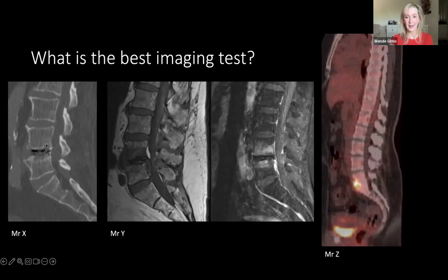This look right here. Have you been taught that, Mike? Have you heard that, that if there's a vacuum disc, there cannot be infection? Or is that not something you ever heard?